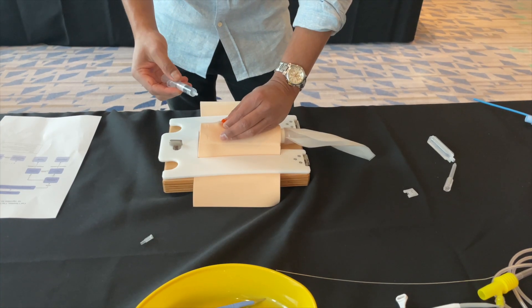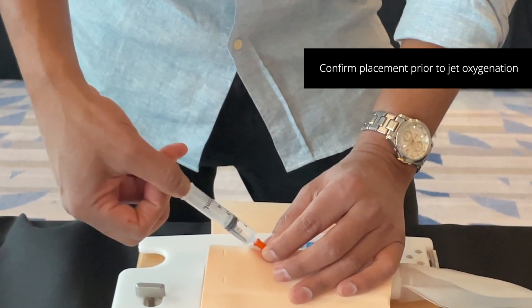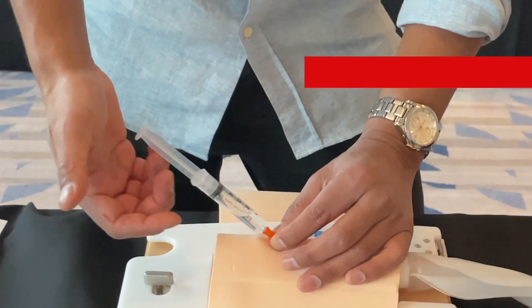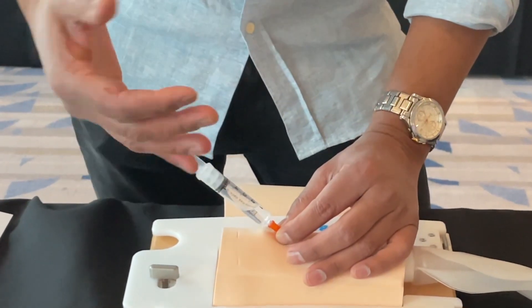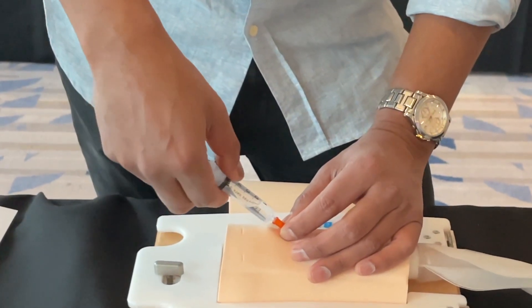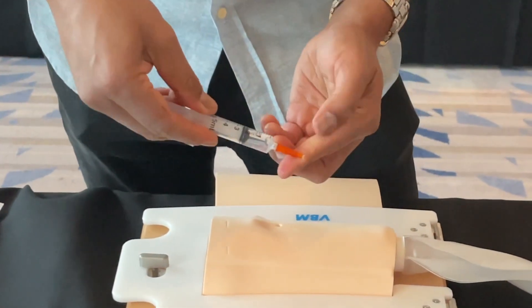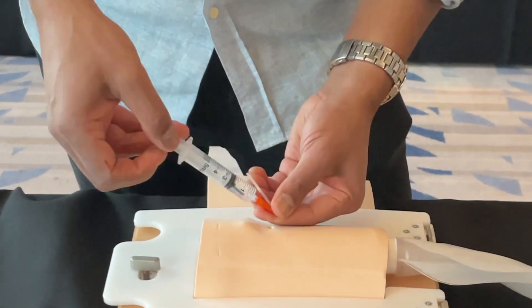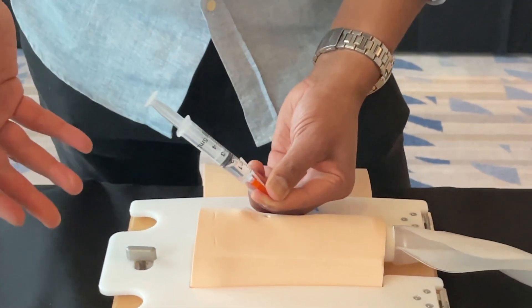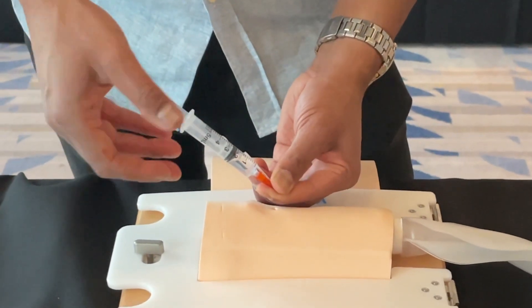This next step is absolutely critical — I want to confirm that I'm in the right spot. I reattach my syringe and confirm aspiration of air. What you notice is that the plunger doesn't recoil. If this was in the wrong position or up against an obstruction, you'd get recoil of that plunger. If I was in the wrong position — such as a blockage or the wrong site — you could see air in the chamber, but if I let go, you see the plunger recoils. No free aspiration of air means it's in the wrong position.